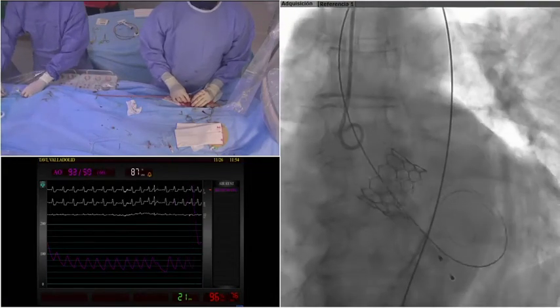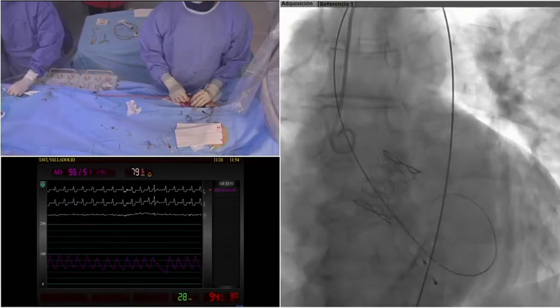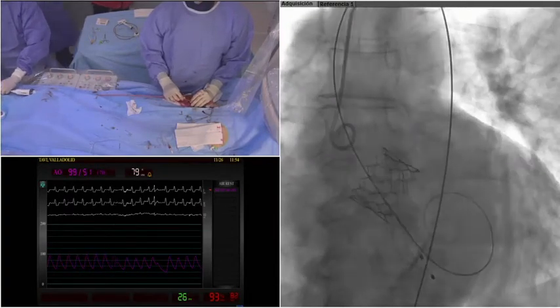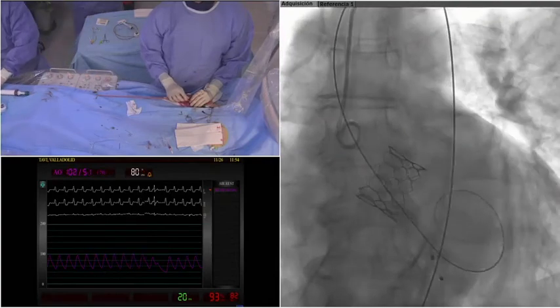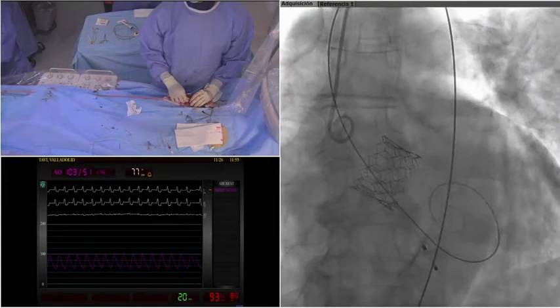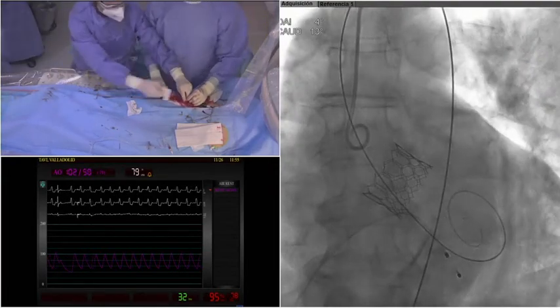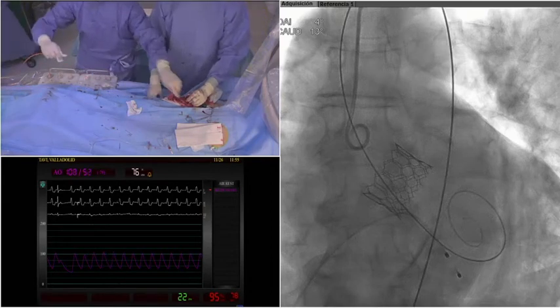So we made this pressure thing just to put some emotion on the case. Yeah. We are removing the balloon, and it seems from angio, from what we have predicted, that the alignment is good. But we are going to show you now the heart navigator.